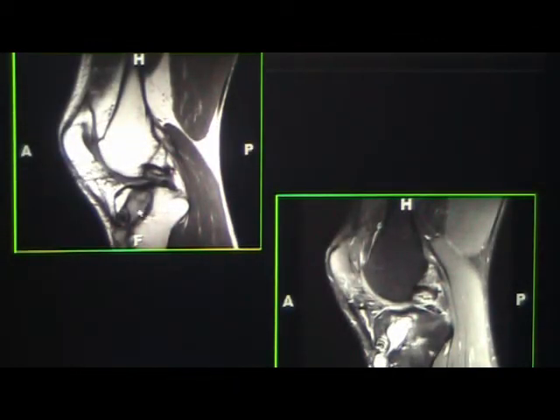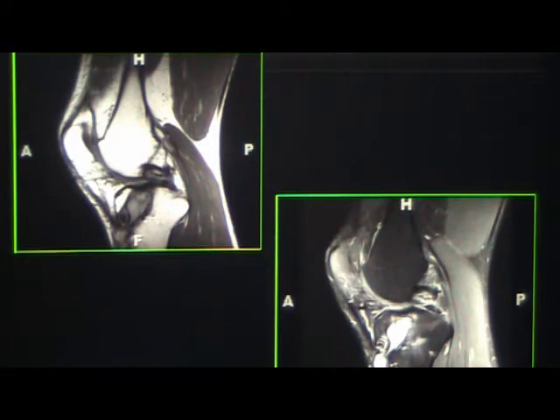Here is an ACL graft with mucoid degeneration. Due to that, there's edema there. If you look on the non-fat-saturated image, there's nothing there. So you don't worry about that — it's just a post-op change.